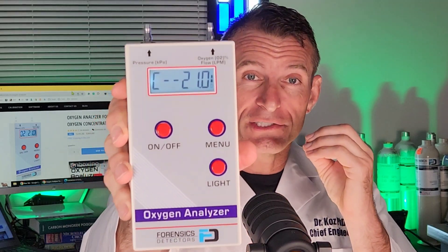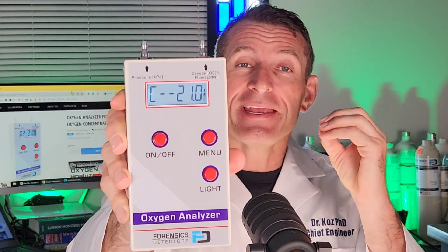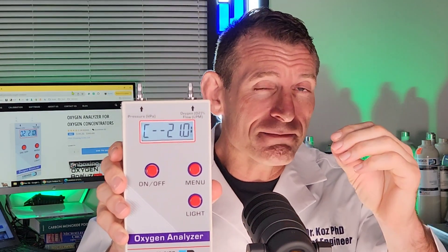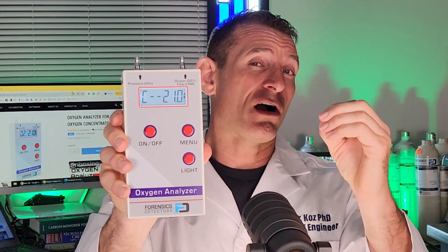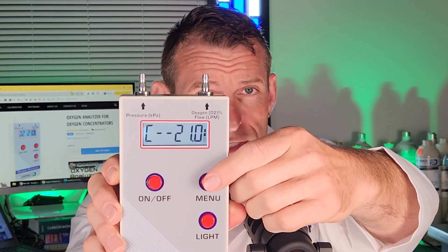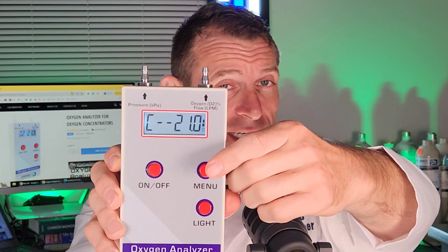Welcome, oxygen analyzer experts. Today we are presenting our FD-OXY 1000 — it's probably the most popular, most sought-after oxygen analyzer to test oxygen machines. It's a beautiful unit because it incorporates a very advanced ultrasonic oxygen sensor. You can go through the menu: C is for concentration, currently reading 21%, which is what it has in the sensor at the moment.